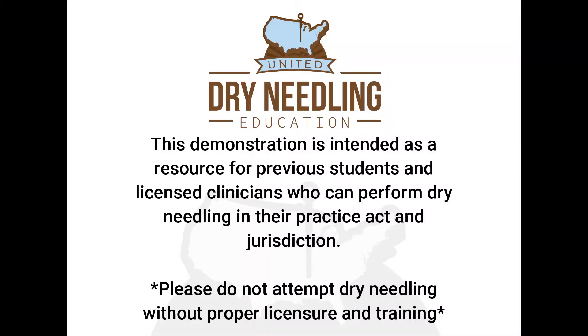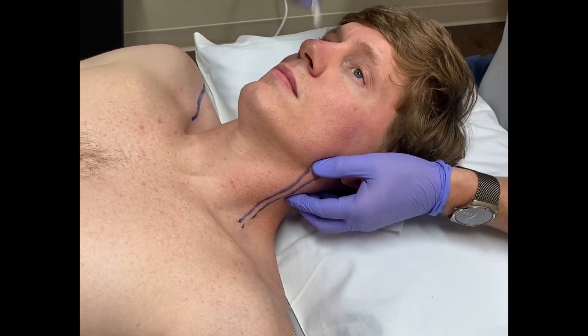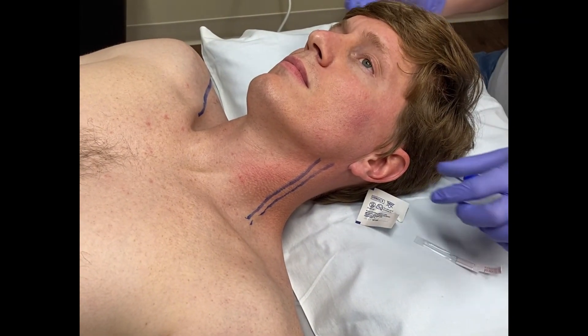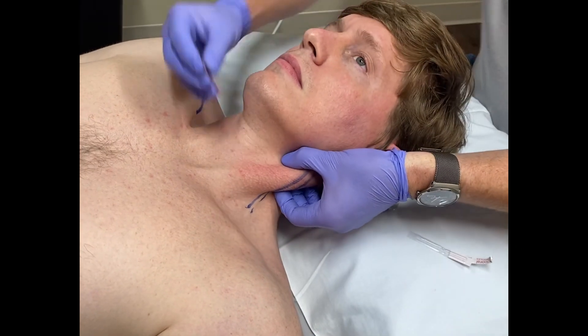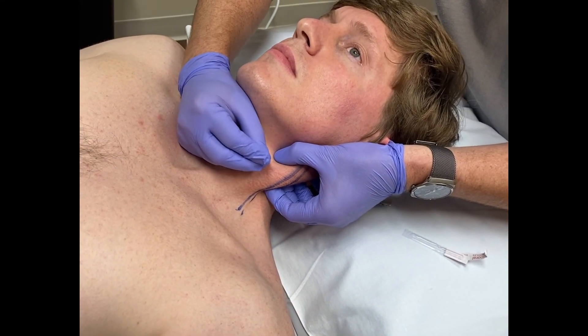For a refresher on needling the sternocleidomastoid, you can search our YouTube channel or find it in the face and TMJ section of our playlist. This demonstration is intended as a resource for previous students and licensed clinicians who can perform dry needling in their practice jurisdiction — please do not attempt dry needling without proper licensure and training. Key precautions include awareness of the jugular vein and vital structures in the anterior and posterior cervical triangles. Use a 15 to 30 millimeter needle, have the patient lift their head to identify the muscle, use clean technique with gloves and an alcohol wipe, grasp the muscle belly, identify the jugular vein via Valsalva or ultrasound, and then tap the needle in and piston or leave in situ.